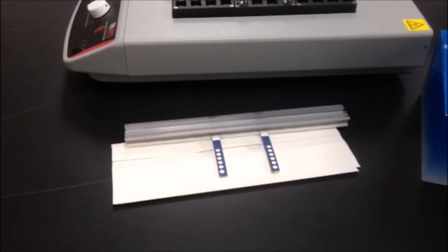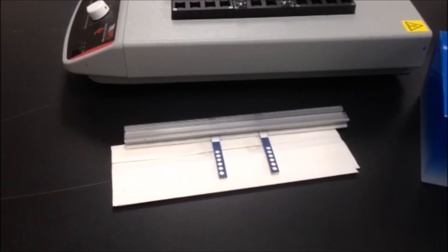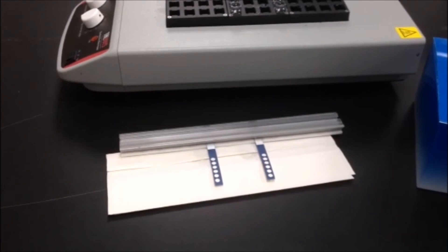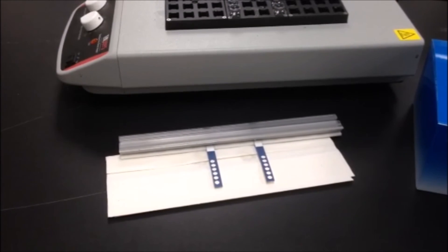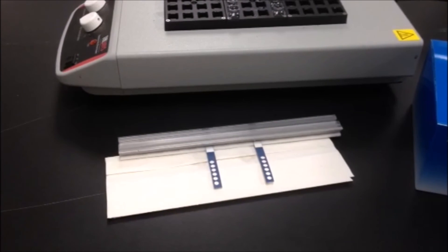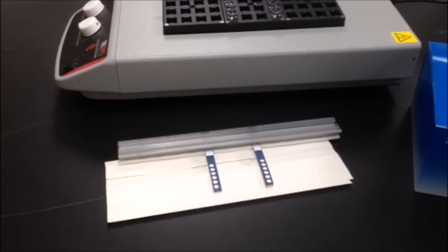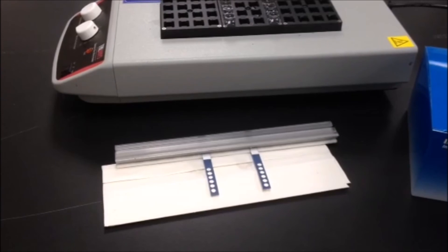Please refer to the immunodot package insert for complete assay instructions and for results interpretation. The immunodot immunoassay is a fast enzyme immunoassay for determining the presence of multiple patient antibodies simultaneously with minimal equipment or supplies.